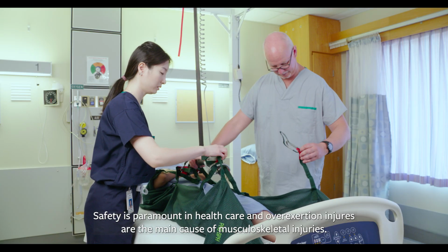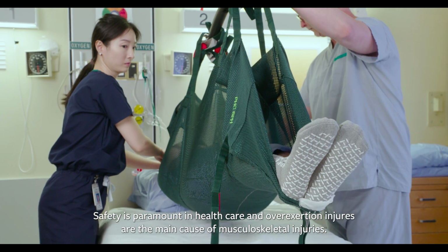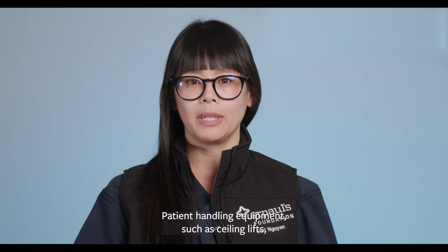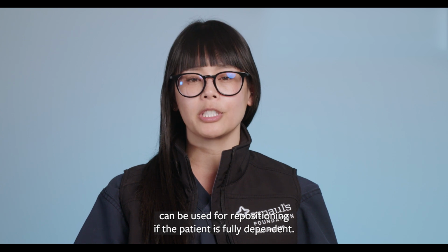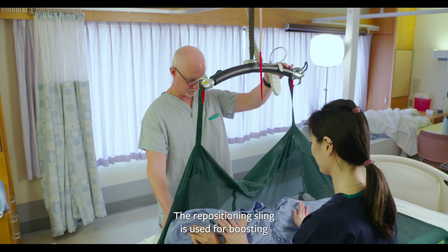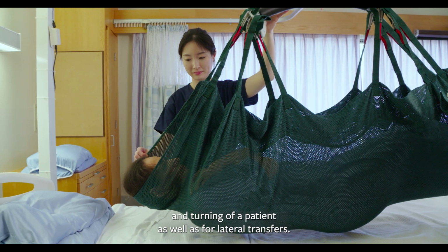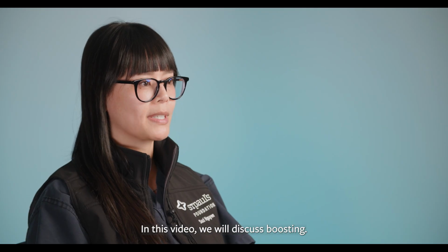Safety is paramount in healthcare, and overexertion injuries are the main cause of musculoskeletal injuries. Patient handling equipment, such as ceiling lifts, can be used for repositioning if the patient is fully dependent. The repositioning sling is used for boosting and turning of a patient, as well as for lateral transfers. In this video, we will discuss boosting.